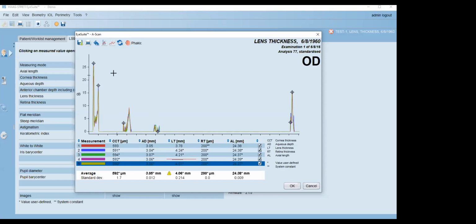Notice my cursor is a plus sign throughout the graph until I click on the zoom scan, which is a graph with a little magnifying glass in the upper right-hand corner. And when I click the zoom scan to activate my highlighter, my cursor actually changes to a double-headed arrow.